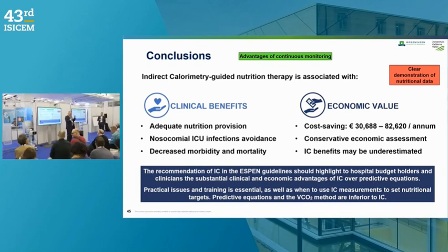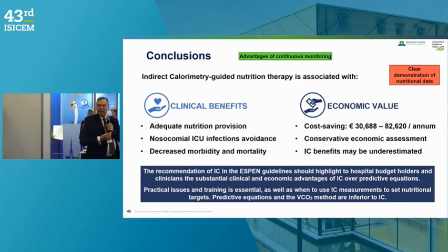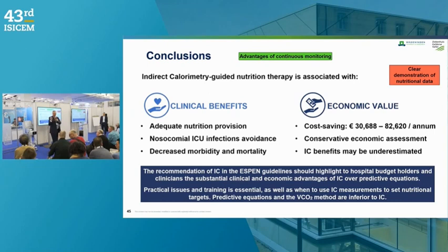Yeah, the idea is probably that you compress the volume and that it may lead to, well, differences in the measurement technique in the device. But I hear more and more that intensivists go to 14, sometimes 16, and don't see major differences in the readings. I think a very high FiO2 is more a problem, because then it becomes very difficult for the device to measure it. I think we're maybe at the last question, and then we have to stop the session.